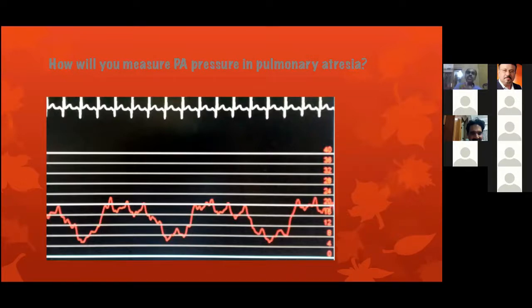The assumption of all the end diastolic pressure assessment is a steady state respiration wherein the person is having a normal inspiration and normal expiration, and the normal inspiratory and expiratory variation is within the acceptable limits of 0 to 6 centimeters of water. But if you are having a significant obstructed airway, which is causing a profound inspiratory fall and a marked expiratory rise, because end expiratory pressures in the chest will increase enormously with airway obstruction, and the inspiratory pressures will go very negative with inspiratory stridor.